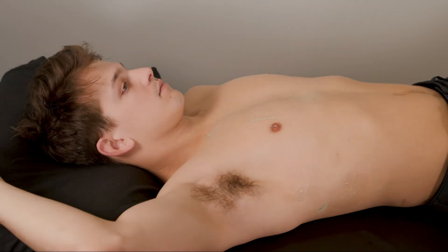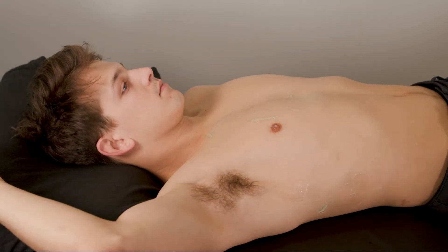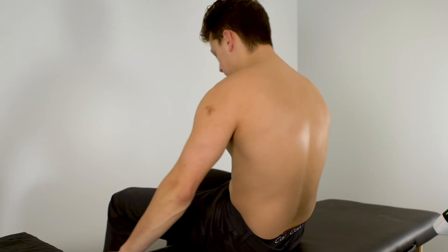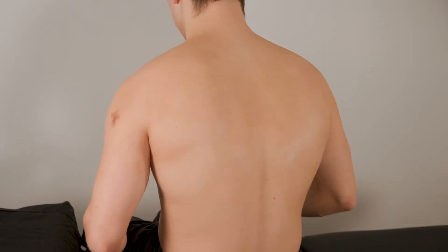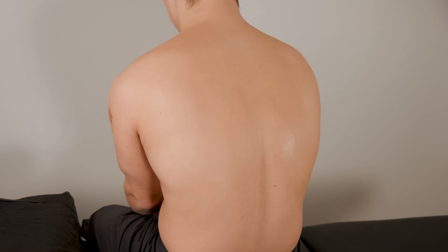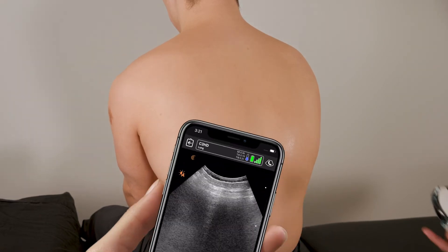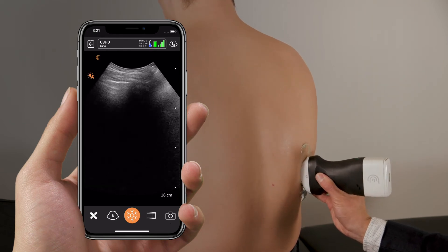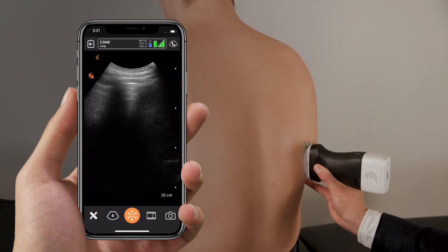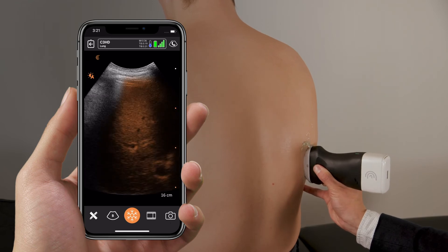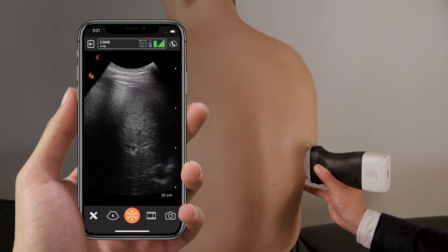To visualize the posterior chest, you would have the patient sit up. It's helpful to have the patient internally rotate both arms or both shoulders to move the scapula laterally to expose more of the upper lung. Start low down and identify your liver so you know that you are at the inferior lung edge.